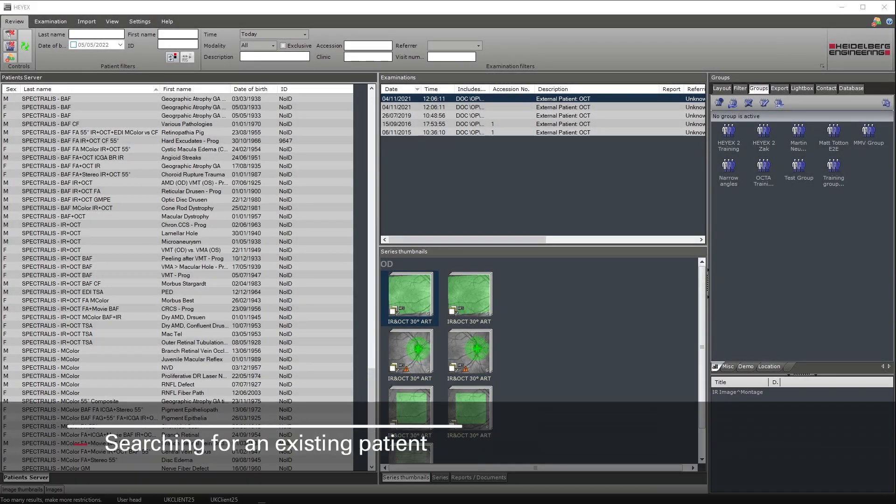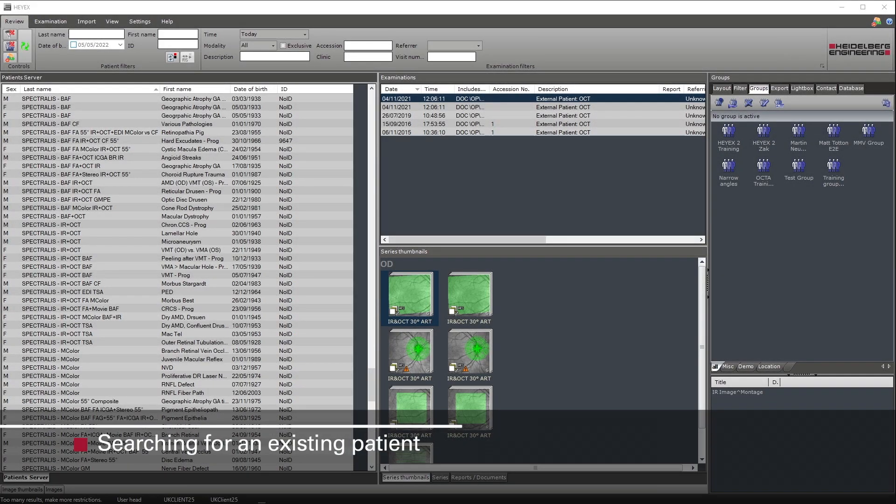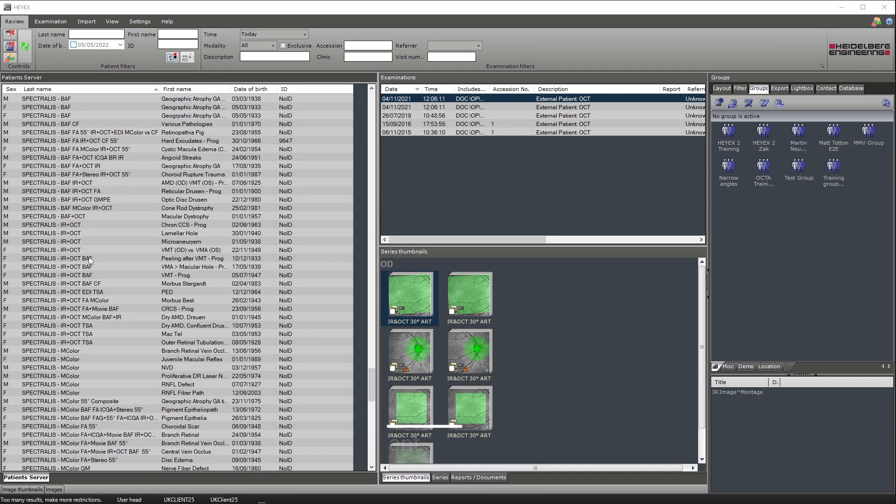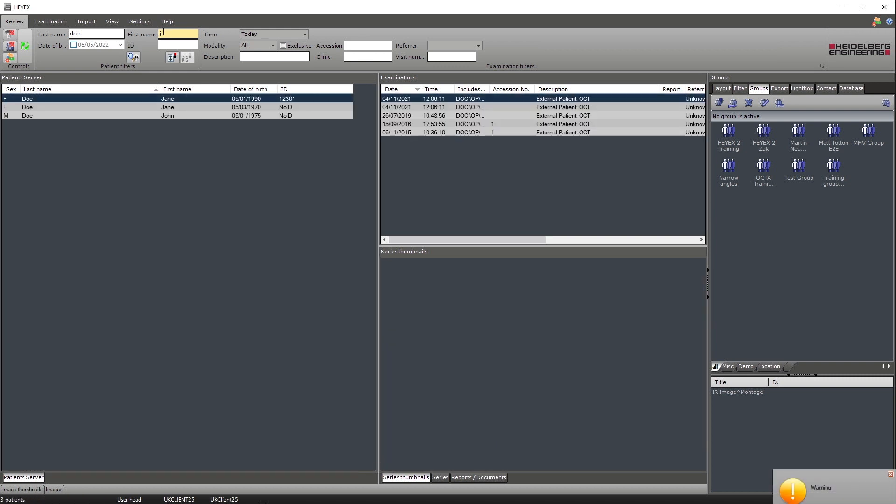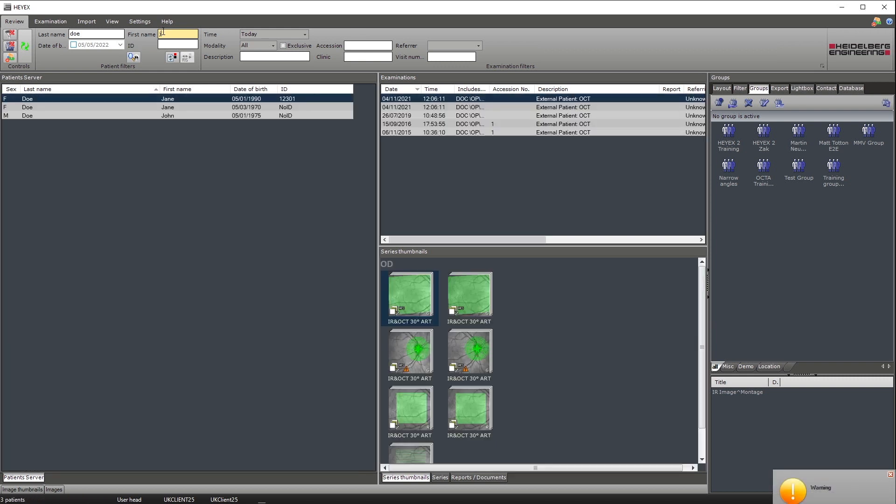To search for existing patients, select the review tab on the ribbon bar. By entering one of the four fields - last name, first name, date of birth, or ID - and then pressing enter, the patient will then appear in the patient server window.